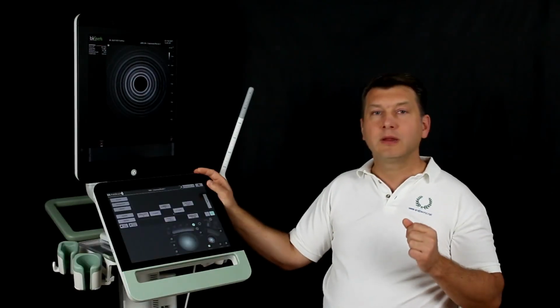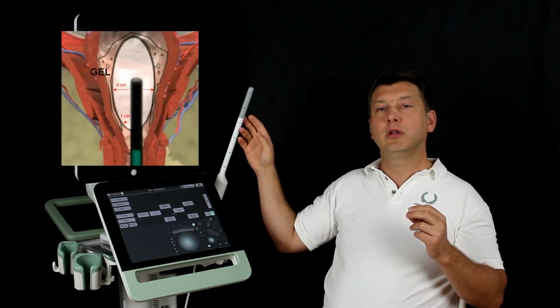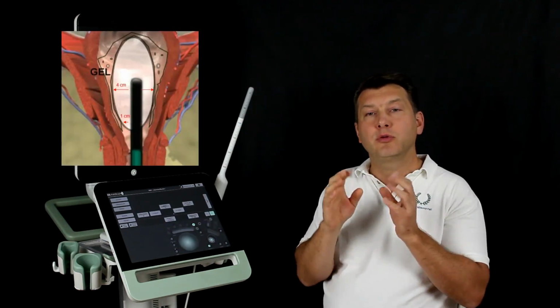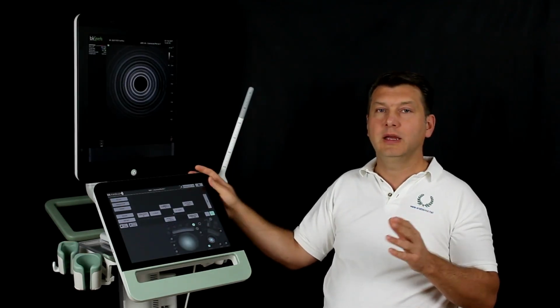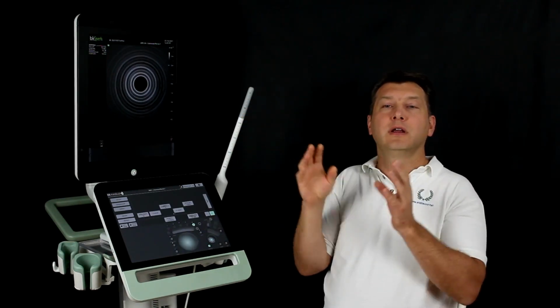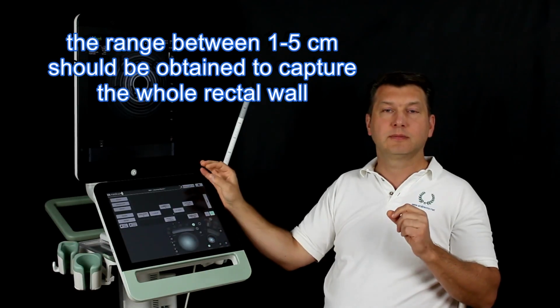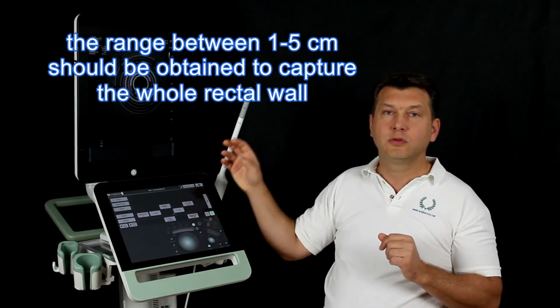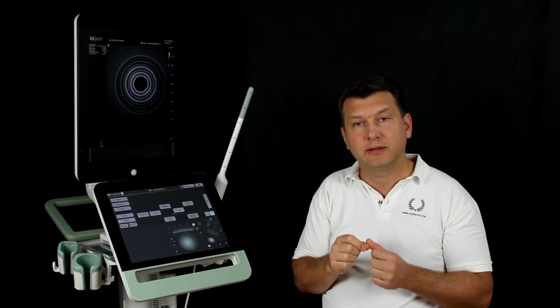The depth. Here we can assume that the rectum wall in the upper and in the lower pole of the transducer will be closer to the probe, 0 until 1 centimeter. In the middle of the probe, pushed up by the balloon, the rectum wall is on the other hand at about 3 until 5 centimeters distance. If the depth is chosen too small, some parts of the rectum wall layers may no longer be displayed.